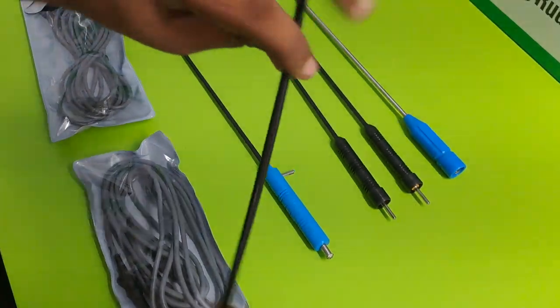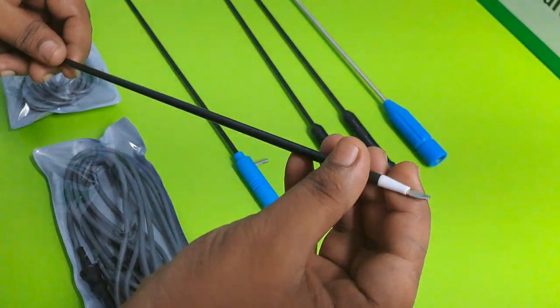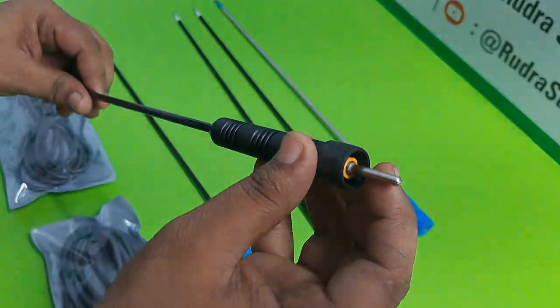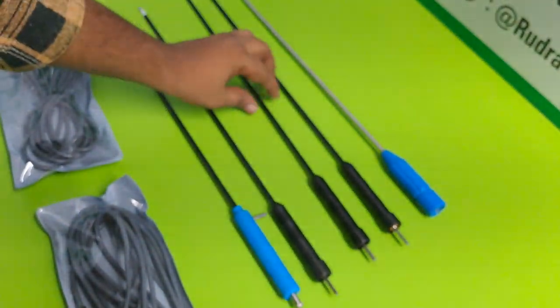This is the Spatula — the Spatula with Ceramic. And this is the Monopolar Pin for electricity.